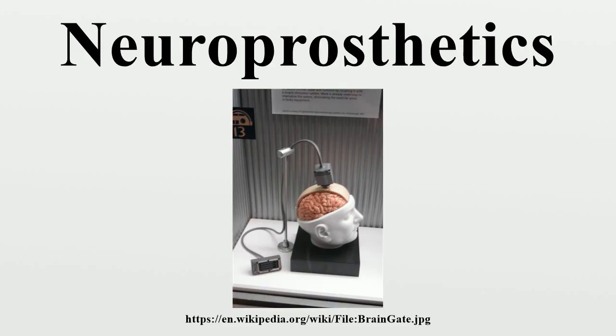The first clinical trial of a permanently implanted retinal prosthesis was a device with a passive microphotodiode array with 3,500 elements. This trial was implemented at Optobionics, Inc. in 2000. In 2002, Second Sight Medical Products, Inc. began a trial with a prototype retinal implant with 16 electrodes. The subjects were 6 individuals with bare light perception secondary to RP. The subjects demonstrated their ability to distinguish between 3 common objects at levels statistically above chance. An active subretinal device developed by Retinal Implant GmbH began clinical trials in 2006.